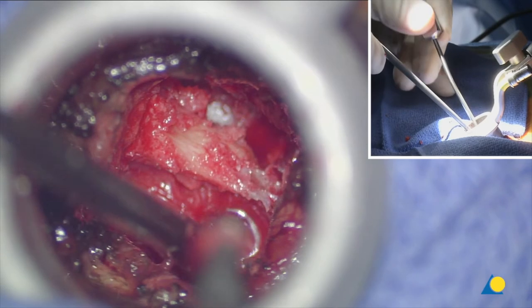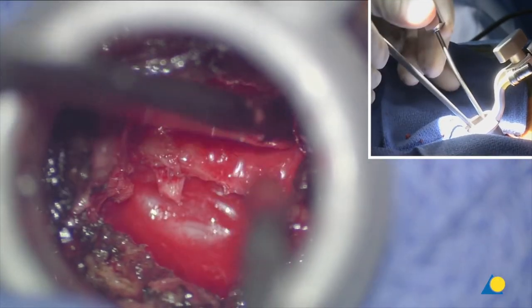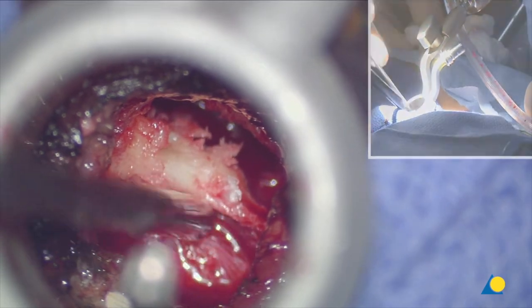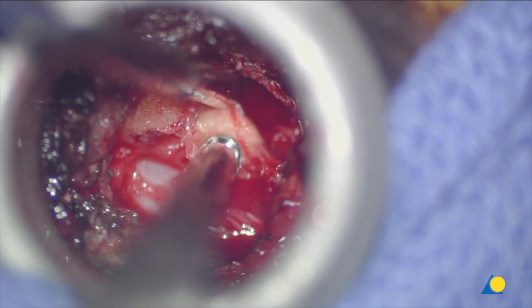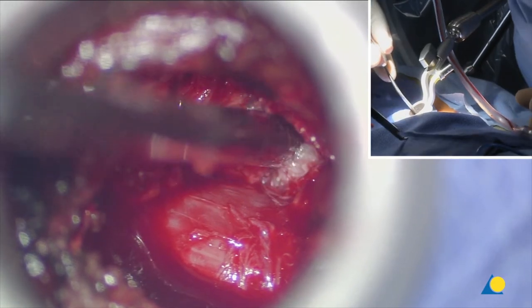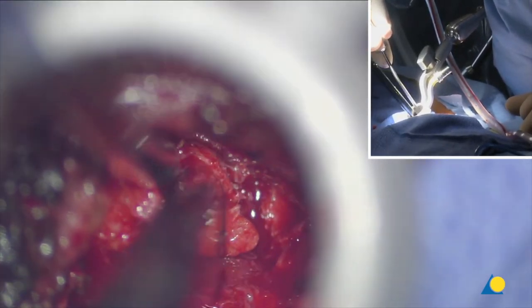We're getting a little bit into the cancellous bone of the contralateral lamina, which is fine. If you go too far lateral here you could get into the joint and cause problems. Now since I've decompressed the ligament I can go in and remove it — the superficial parts I take with a three-millimeter Kerrison. Now we're working our way south, removing more of that ligament.